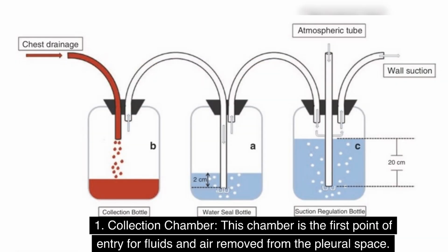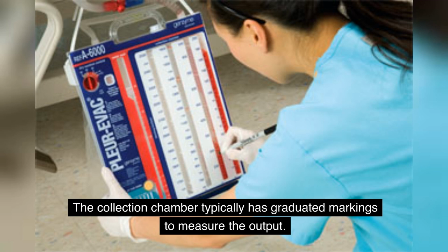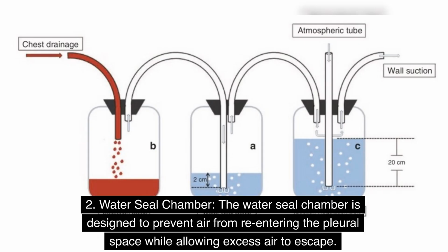Collection chamber. This chamber is the first point of entry for fluids and air removed from the pleural space. It allows healthcare providers to monitor the volume and character of the drainage. The collection chamber typically has graduated markings to measure the output. 2. Water seal chamber. The water seal chamber is designed to prevent air from re-entering the pleural space while allowing excess air to escape.